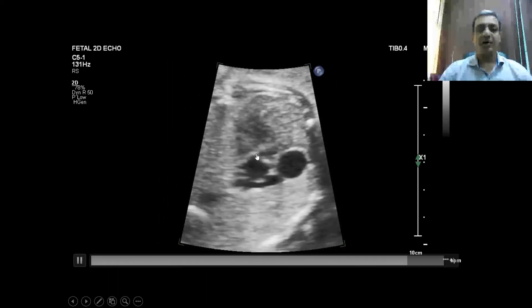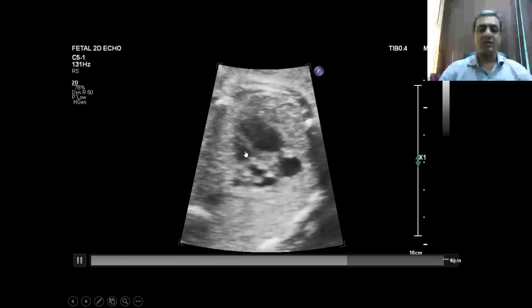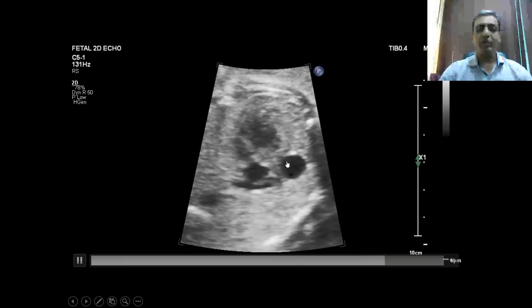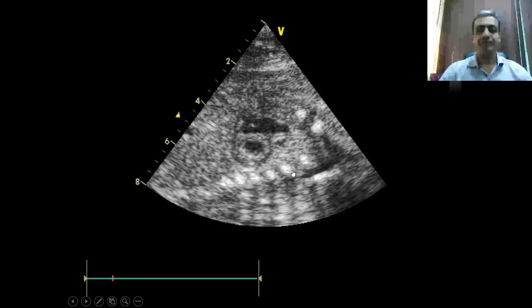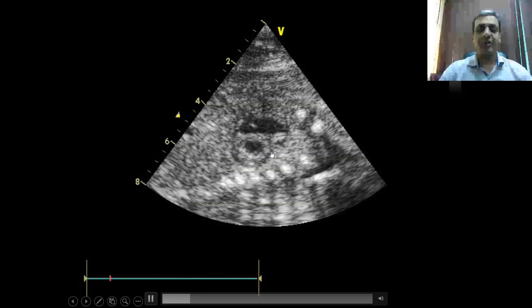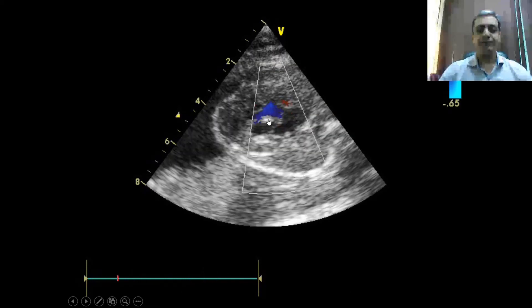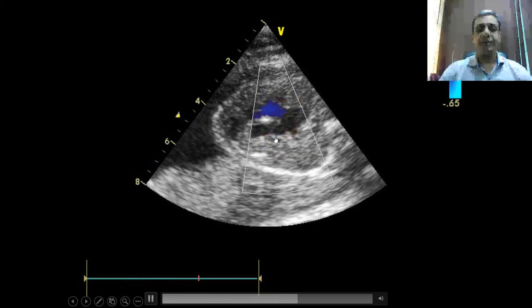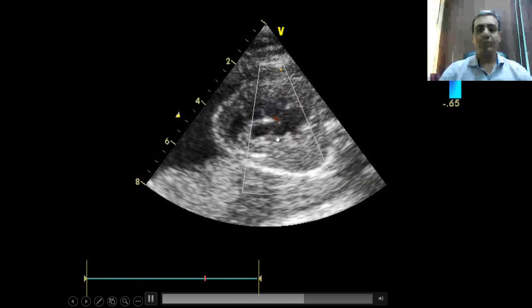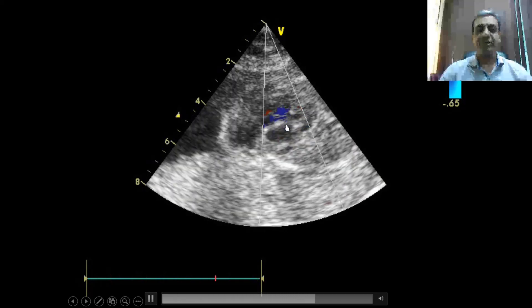Another four-chamber view allows us to appreciate a very small mitral valve, a mildly dilated left atrium, a small left ventricle, a big right ventricle giving rise to a dominant pulmonary artery. On the short axis view, the left ventricle is not at all contractile while the right ventricle is contracting well. Color Doppler across the mitral valve shows significant mitral regurgitation, suggesting a dysplastic mitral valve.